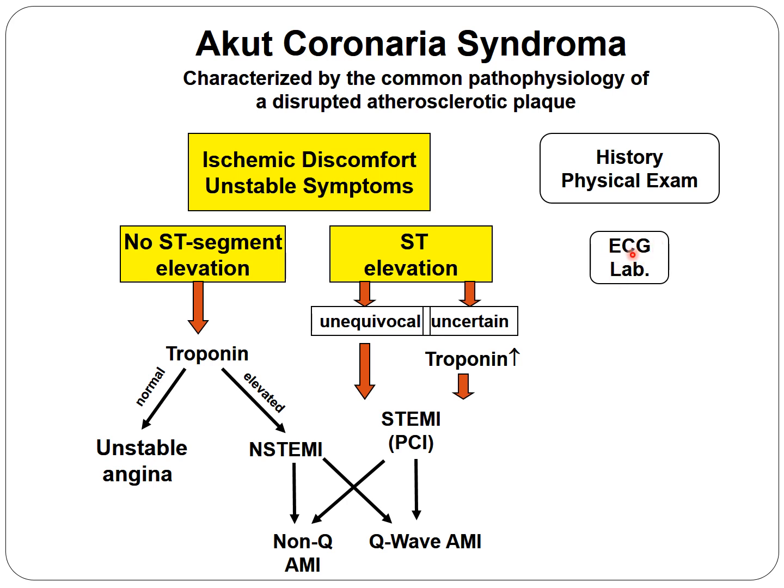Based on the ECG findings, two different categories can happen. Let's see first when we have characteristic changes such as ST elevation. If we have a very big, very informative ST elevation, immediately the patient can be sent to the coronary unit where they can perform angioplasty or dilate the coronary or implant a stent, and this is how they are going to prevent the development of necrosis.